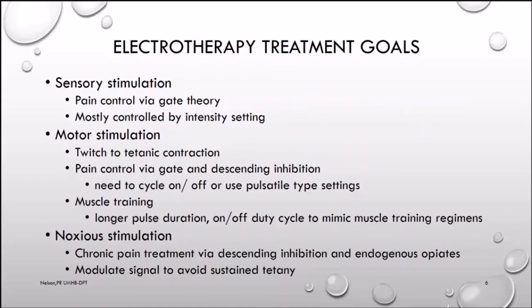What are our goals of electrotherapy? So sensory stimulation is pain control via the gate theory. It's mostly controlled by the intensity setting, so almost any device that you have can be delivering electric stimulation at a sensory level, even your direct current device. Now that might not be your first choice, but anything can do sensory stimulation.